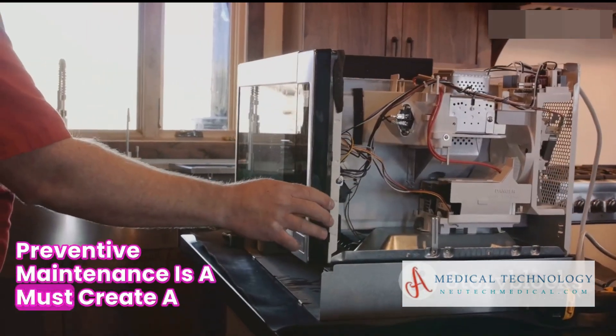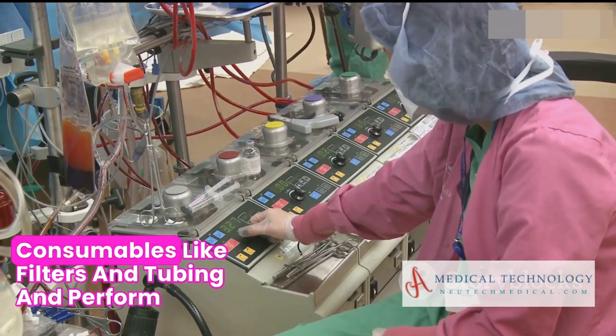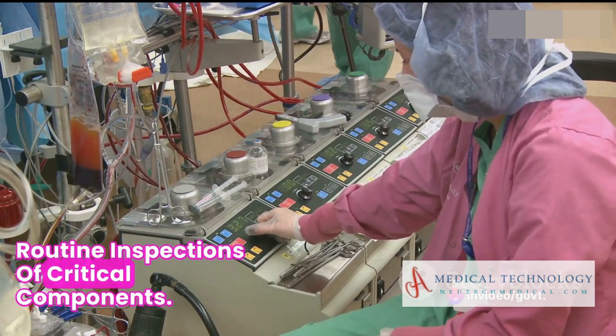Preventive maintenance is a must. Create a schedule and stick to it. Regularly replace consumables like filters and tubing, and perform routine inspections of critical components.